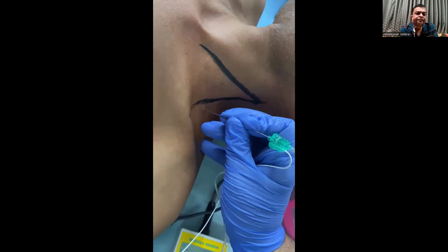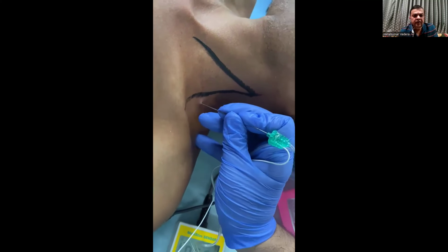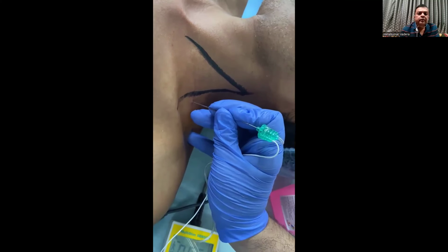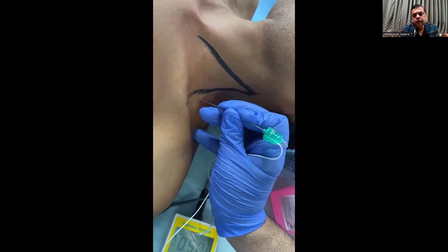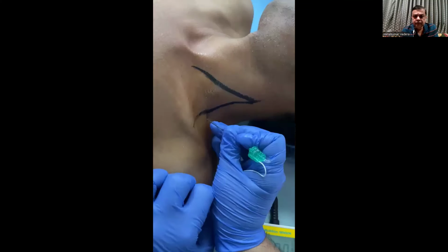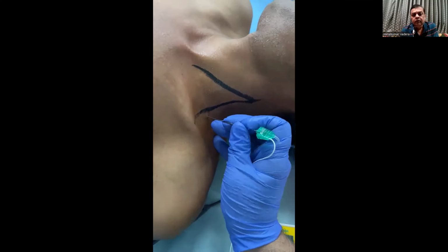If it is for analgesia, I will inject 0.2% ropivacaine. I will inject 0.5% ropivacaine 20 ml if it is for surgical anesthesia. But when it is for surgical anesthesia, you have to supplement it with a superficial cervical plexus block. That is just cutaneous innervation, posterior to the clavicular head of the sternocleidomastoid, and it will block the superficial cervical plexus. So that is how you can do it. That is very easy, and you can get the block very easily.